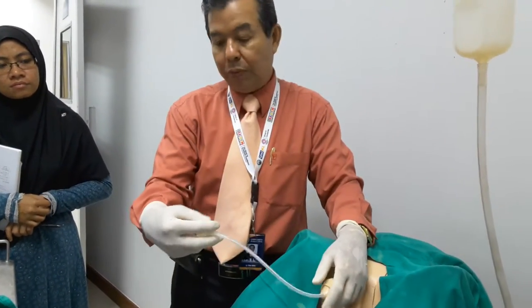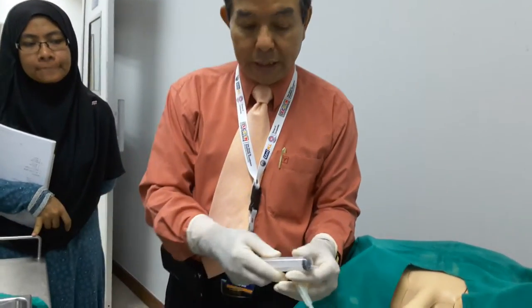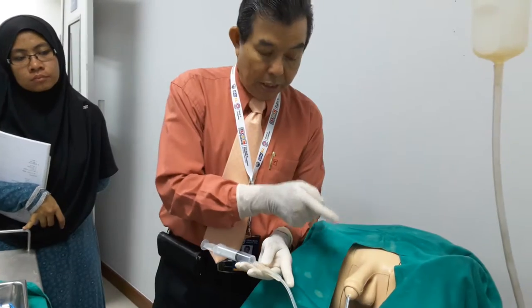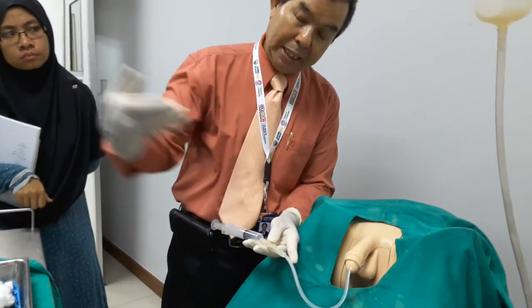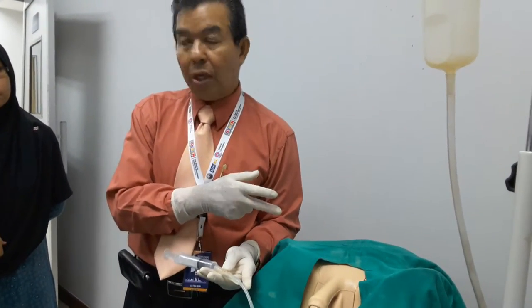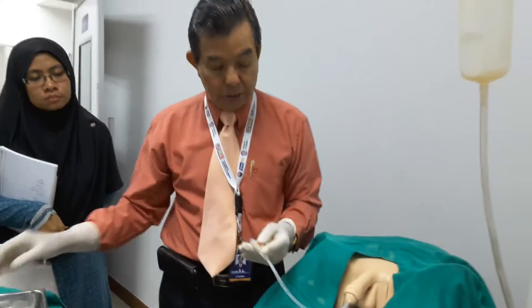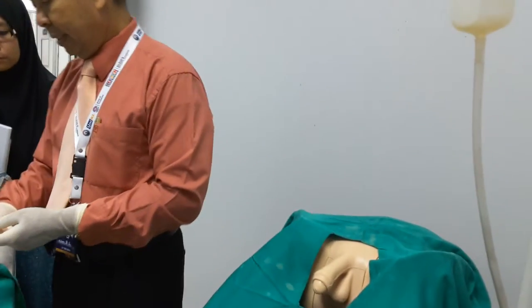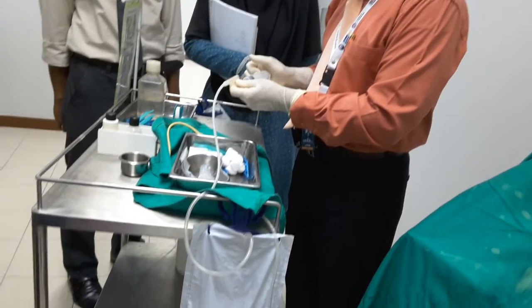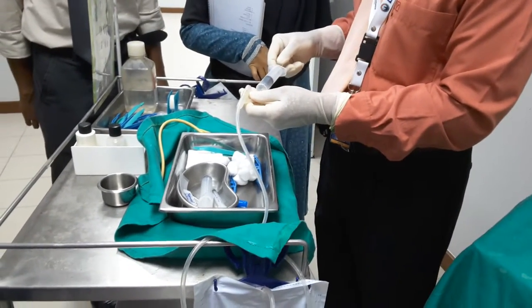Once the catheter is inside, we put in saline or water — about 7 cc — and pump it in. Be careful to ensure the balloon part is already inside the bladder first; otherwise, it may stretch the posterior urethra, traumatize the patient, and cause stricture later on. Once confirmed, inflate the balloon so it stays inside.